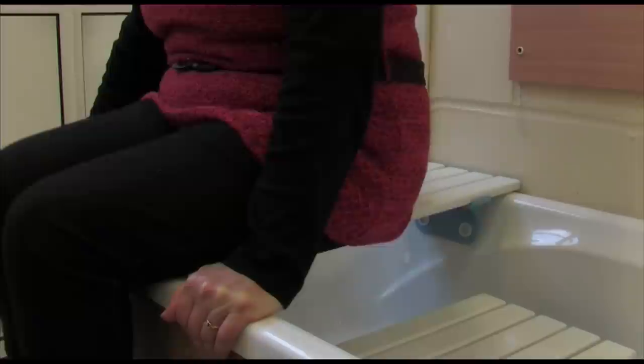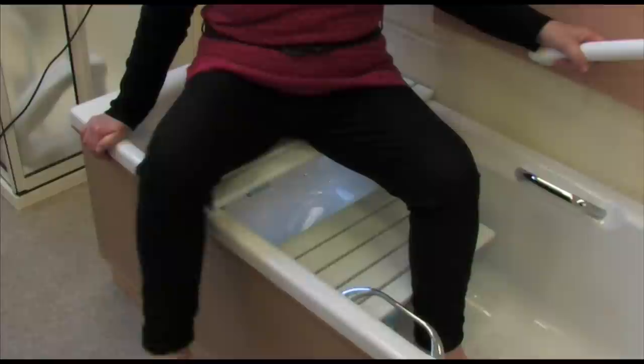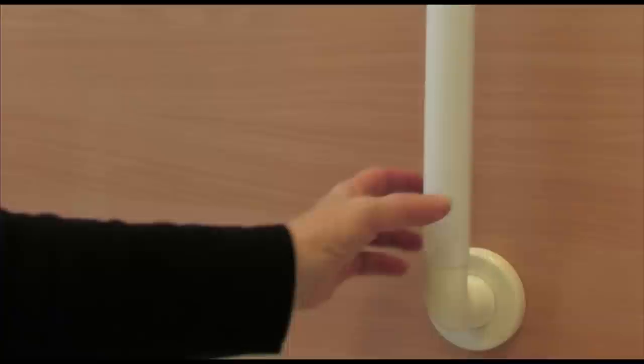Shuffle your bottom back into the centre of the board making it easier to lift your leg into the bath. Now lift your nearest leg over the edge of the bath and now the other. At this point you can shower from the board.